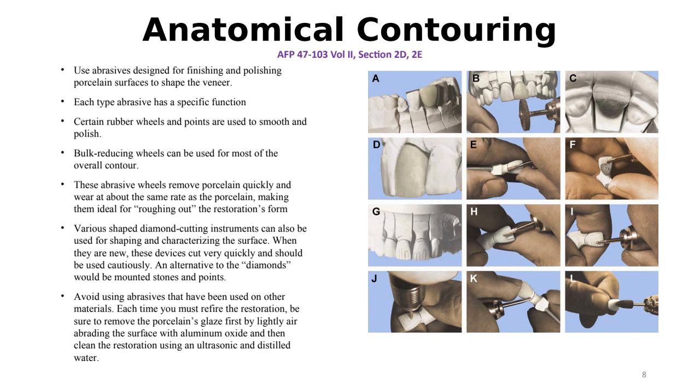And how do you check? Let's say you are in your porcelain phase. You finish building up the porcelain. You grind it. Your porcelain is not shiny because you didn't polish it and you didn't apply your glaze. So it has that matte, dull look, right? And you put a groove in there, and because of the texture and the look of the porcelain, you can see that groove very well. What can you do to make that texture pop?